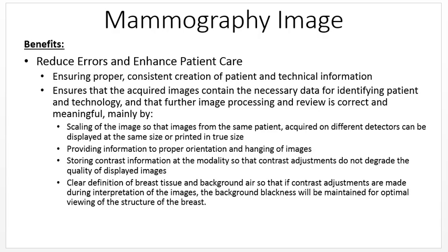Benefits that reduce errors and enhance patient care are a good thing. My favorite benefit is providing information to proper orientation and hanging of images. If you ask me what I spent the most time on over 13 years as a PACS admin, I would say building mammo hanging protocols is what I did more than anything else. So having the correct orientation information every time will save you a lot of work.